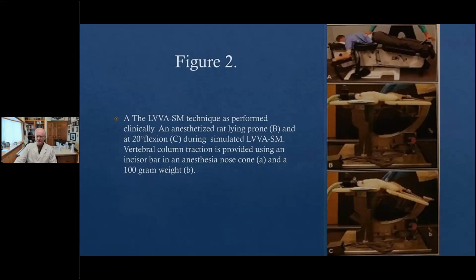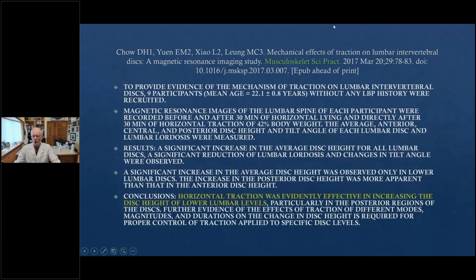This is low velocity variable amplitude spinal manipulation, as opposed to high velocity, low amplitude spinal manipulation. As you know, some people cavitate, some people can tolerate the lumbar roll, some cannot. Therefore, you and I need different approaches of spine manipulation and mobilization depending upon patient requirements. So let's study together about how we treat with Cox distraction manipulation.